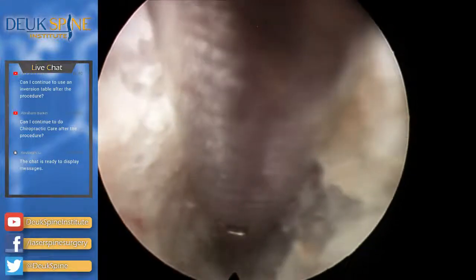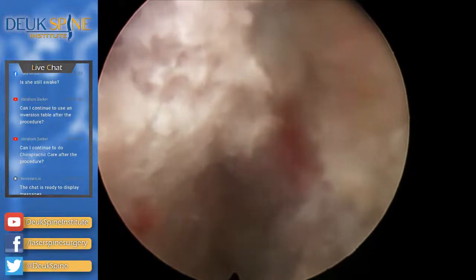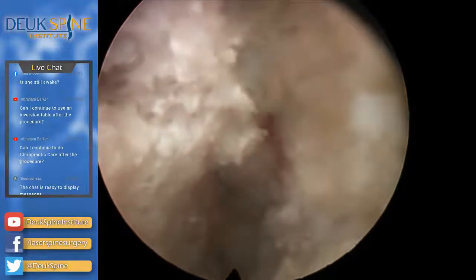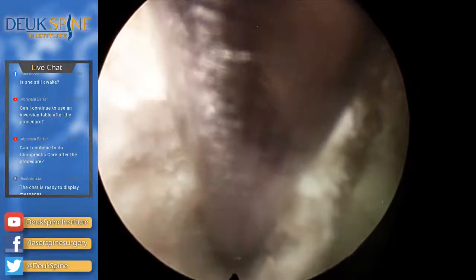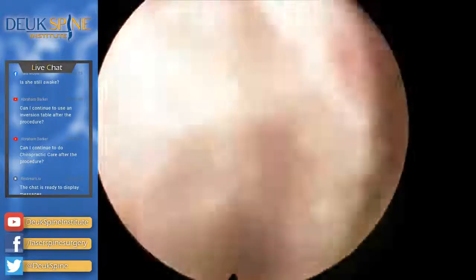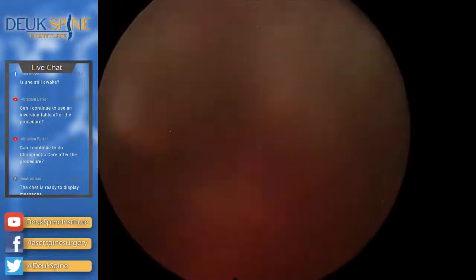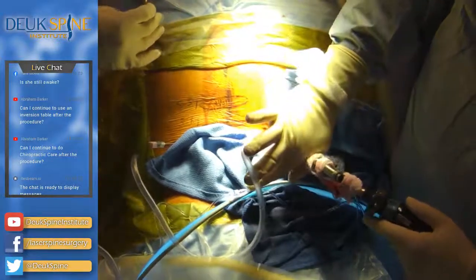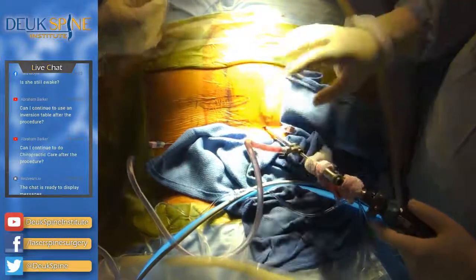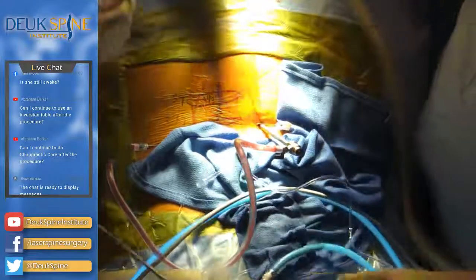Lights off, please. Thank you. Okay, very good. I'm happy with that. Scope off. Scope off.